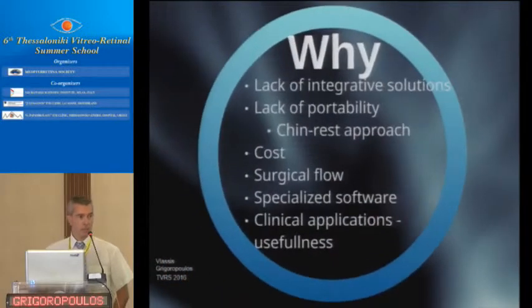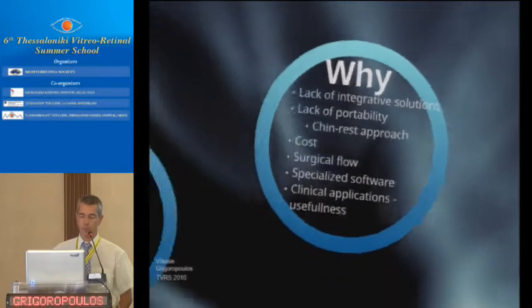But why hasn't the OCT been used for surgery? Because there was so far a lack of integrative solutions. There was a lack of portability. You know, you have the machine in the clinic, the patient has to put his chin on the chin rest, and you have to go and do the OCT. It's a big machine, you can't move it around. It was very expensive. It would heavily disrupt the surgical flow of your cases. You needed specialized software, and also we didn't know if it was clinically useful, if it was good for our patients.